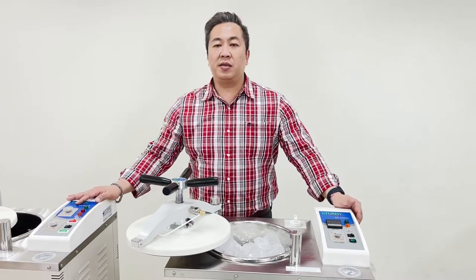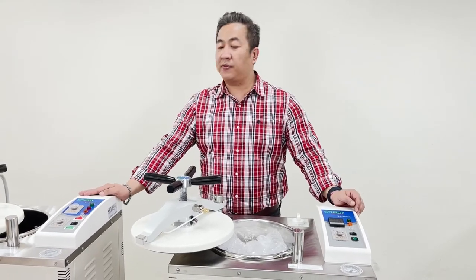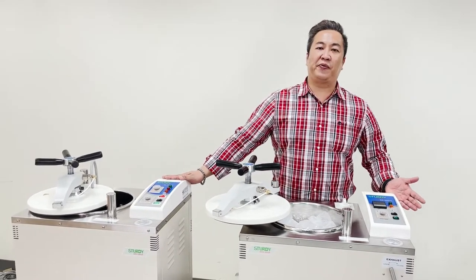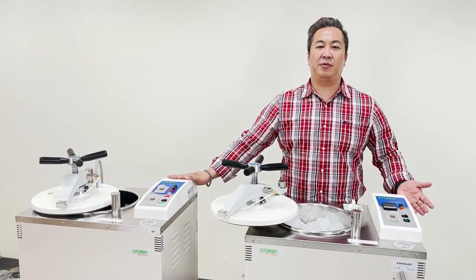Today we have introduced Sturdy Industrial's vertical autoclave — the SA300VF and the SA300VL. If you have any questions, please feel free to contact your sales representative from Sturdy's. Thank you and goodbye.